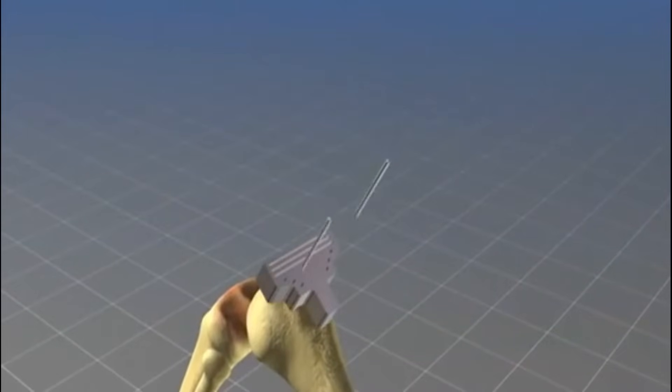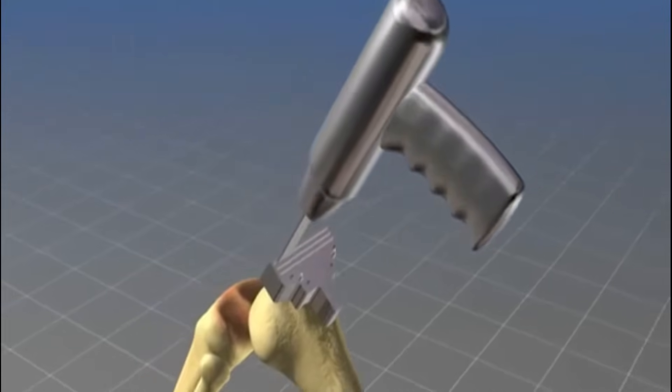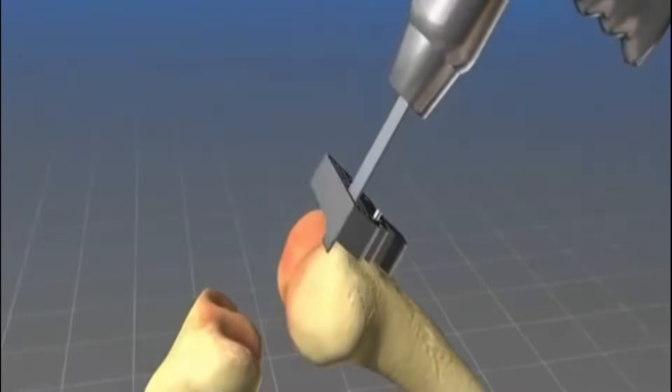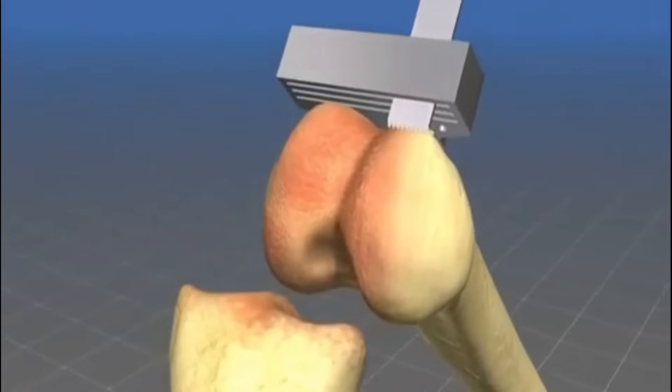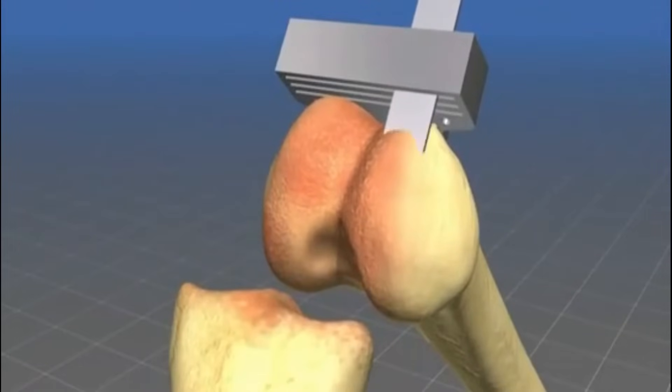When I start with the femur, I remove with a precision saw exactly that amount of the damaged cartilage and bone, which is later replaced by the prosthetic component. In this case, it's exactly 9 millimeters.